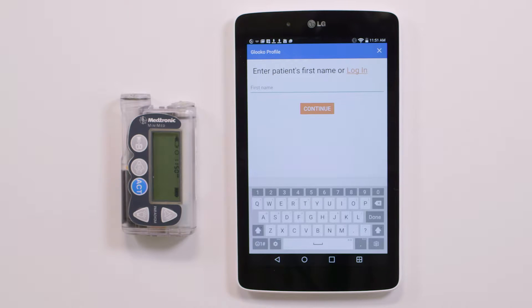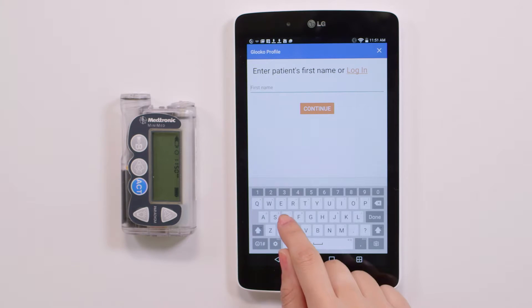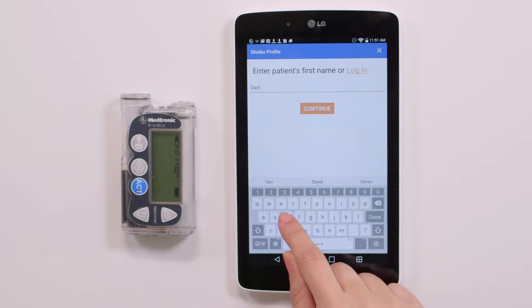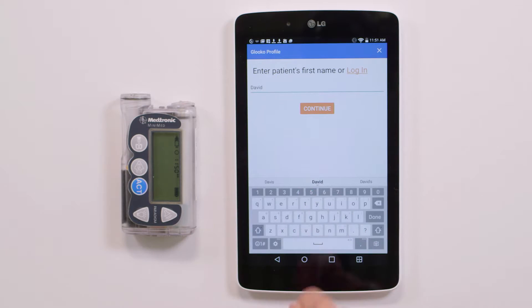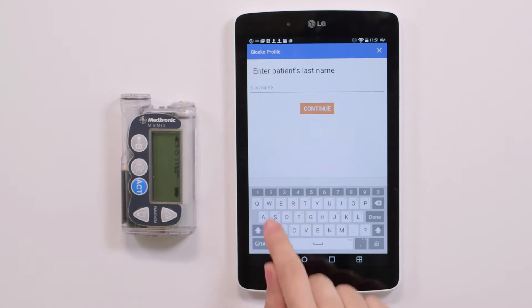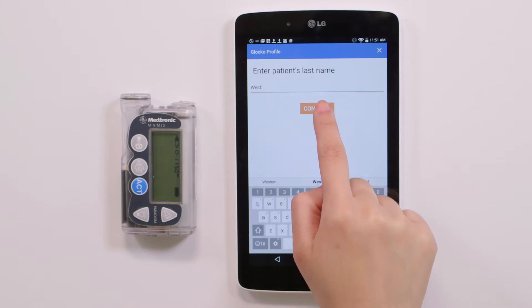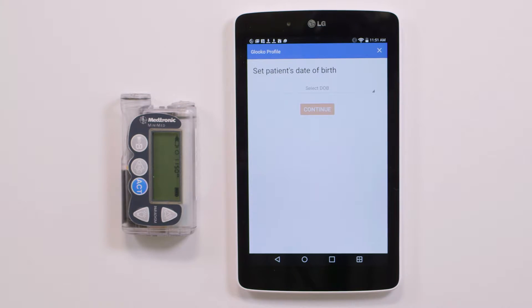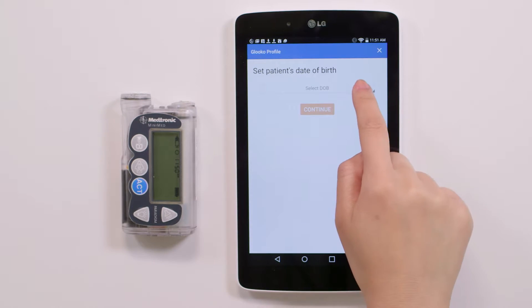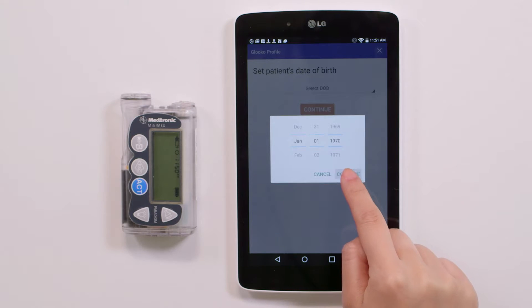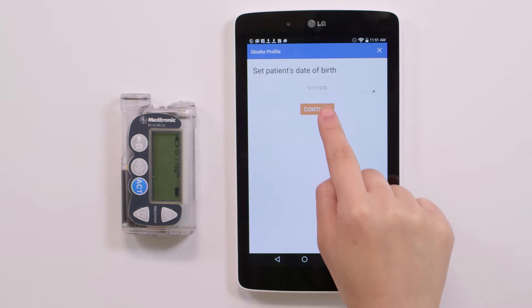Now, Glooko needs to know who is the user of this Medtronic pump in order to match the data to the correct patient. Type in your patient's first name and tap Continue. Enter your patient's last name and press Continue. Tap Select DOB to enter your patient's date of birth, followed by Continue.